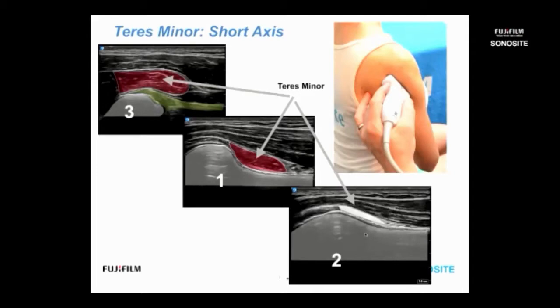And remember, we're scanning the surface of a curved object, so you want to stay 90 degrees to the cortical landmark here. But the triceps tendon makes a really nice landmark as it inserts. This is the long head of the triceps. It inserts to the inferior glenoid as well. It'll kind of hold up the shape of the teres minor. Let me go back one slide.